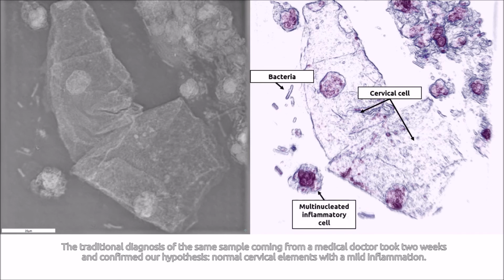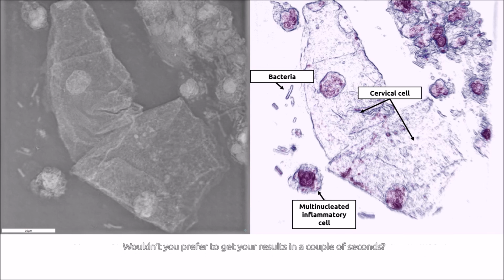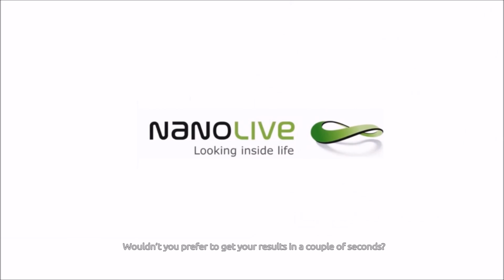The traditional diagnosis of the same sample coming from a medical doctor took 2 weeks and confirmed our hypothesis. Normal cervical element with a mild inflammation. Wouldn't you prefer to get your results in a couple of seconds?